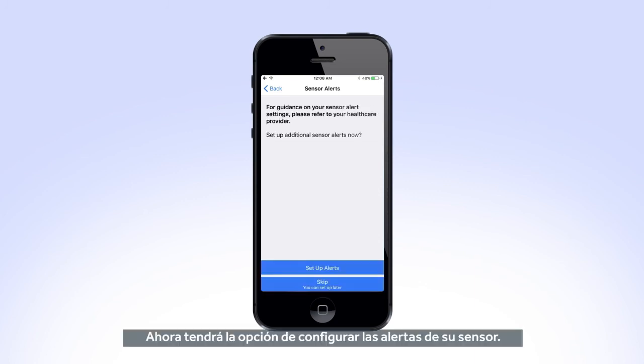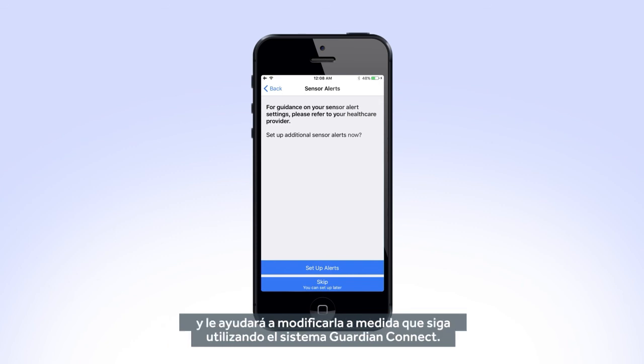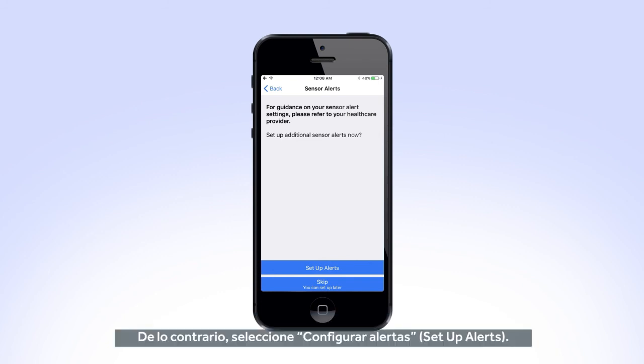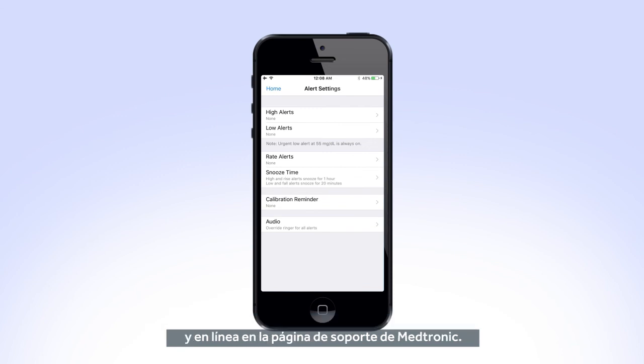Now you will have the option to set up your sensor alerts. Your healthcare professional will work with you to decide what your initial settings will be, and will help you adjust them as you continue to use the Guardian Connect system. If you do not have this information from your healthcare provider, select Skip. Otherwise, select Set Up Alerts. The Alerts Settings screen is where you will set up all of your alerts and notifications. More information on how to set up these alerts can be found in your user guide and online on the Medtronic Support page.